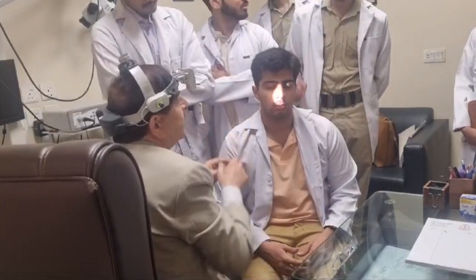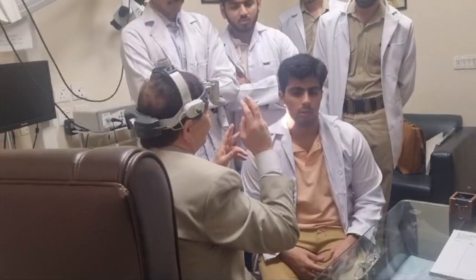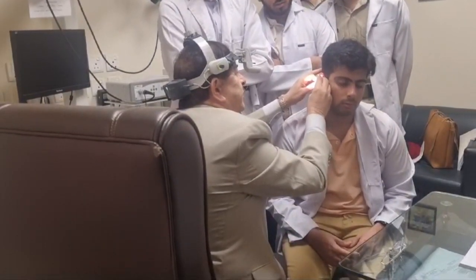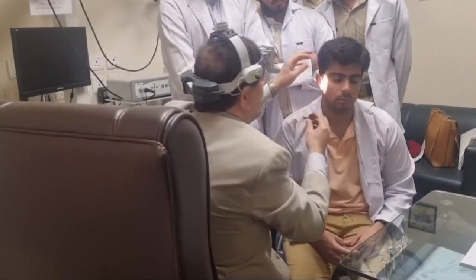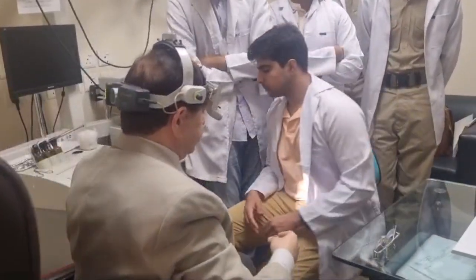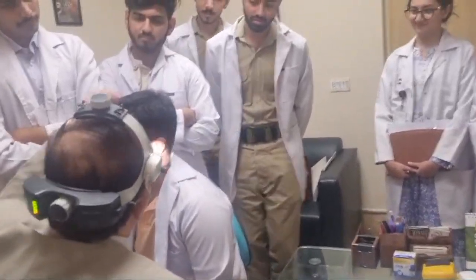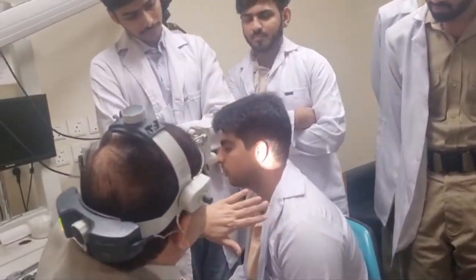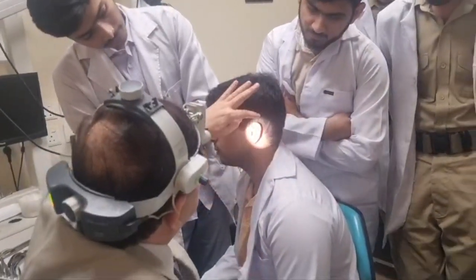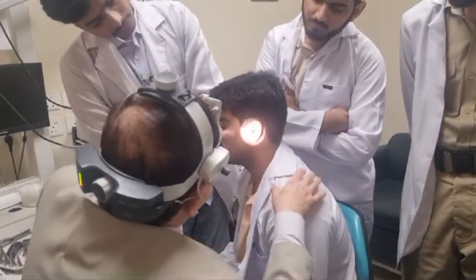Which ear am I examining? The right ear. So we use the right hand for the right ear. Now we are doing it for the other ear as well, slowly inserting the speculum. You can easily insert it.